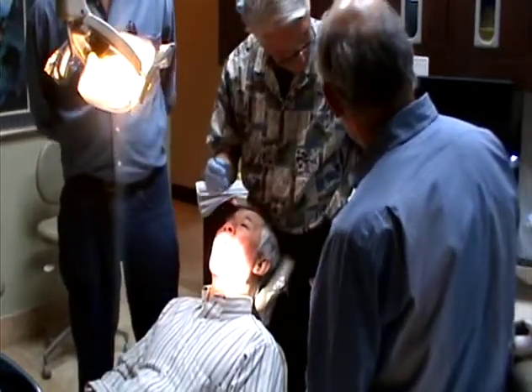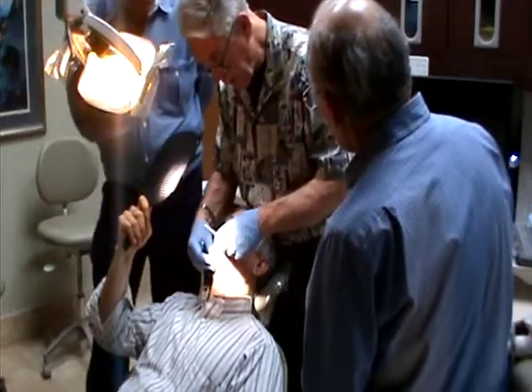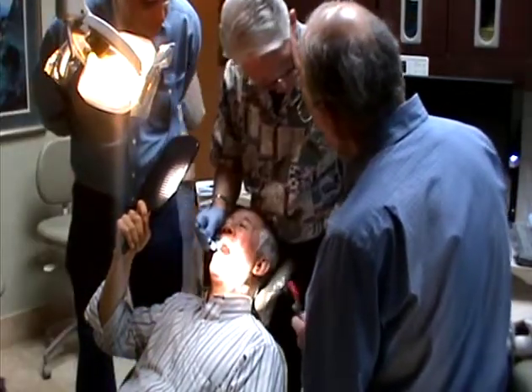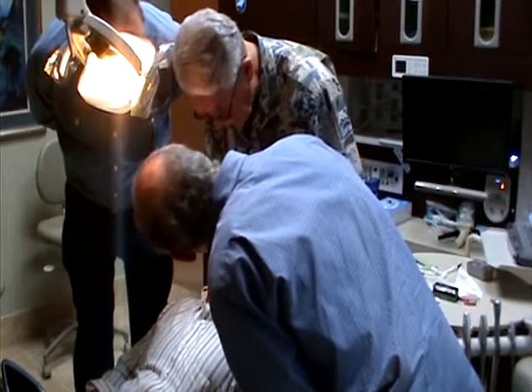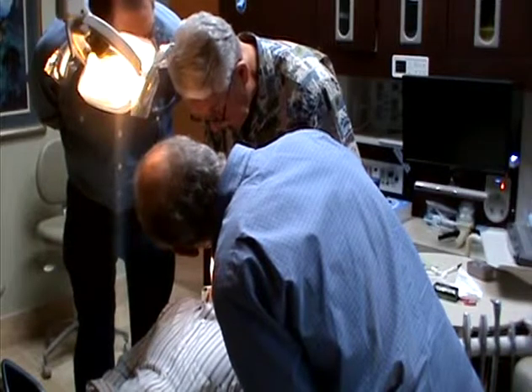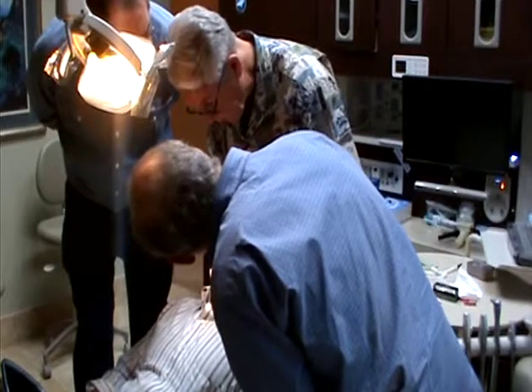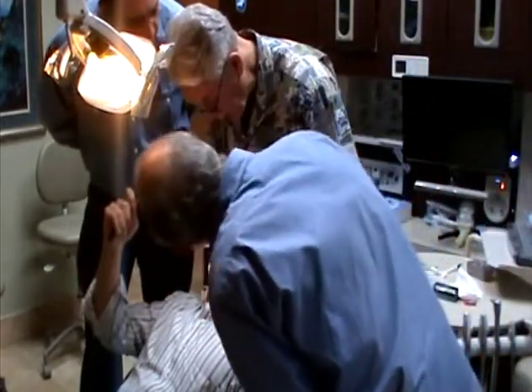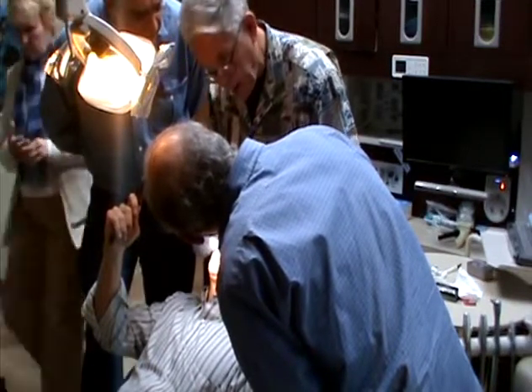That's a cross tooth balancing interference. Those are the most disturbing to the muscle, on the second molar. Slide out for that. Just a little bit. When you see that, when it wraps over the molar, when you slide, you got a cross tooth interference there. I took a little bit off of this to get rid of a little bit of the influence on that slide right here. So this cusp here, when he slides this way, he's supposed to disarticulate here, but he can't hit over here.